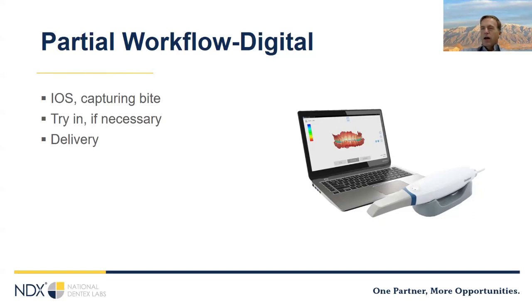So that's cool. If you want to do a try-in, of course you can, and I would recommend it for cases where there's aesthetic concerns. But otherwise, you may be able to go straight to delivery with most of your partials. Again, bites are also much more predictable with an iOS scanner, even if there's only a few teeth in contact, because we don't have to hand set the case. We can actually just bring in the bite that you've taken.